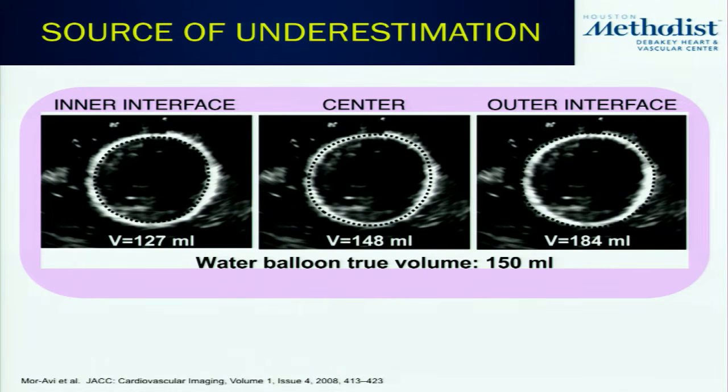So just imagine you have the endocardium here. The border is actually in the middle of this thing. It's not on this side. And it gets worse the further out you are, right? So closer to the transducer, the lateral resolution is less of an issue. But just imagine you're trying to do left atrial volume.